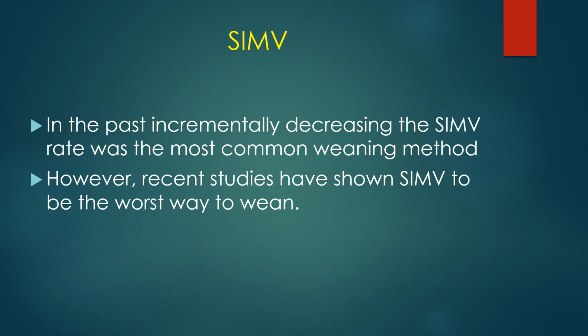And so what if he doesn't? What if all you see is rapid shallow breathing and the patient getting diaphoretic and the CO2 goes up? Well, we just got to put him back on the ventilator. So that made it kind of difficult getting patients off the ventilator. So the ventilator salesman told us that this is how you wean the patient off the ventilator. You gradually withdraw ventilatory support.